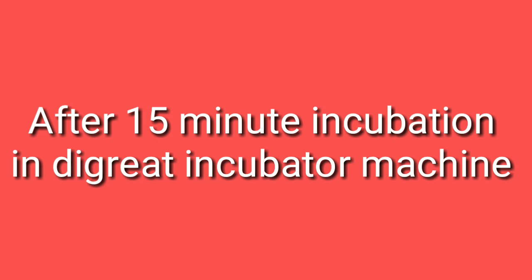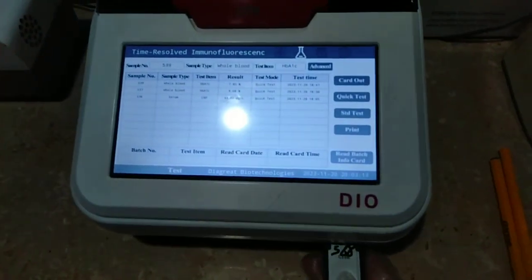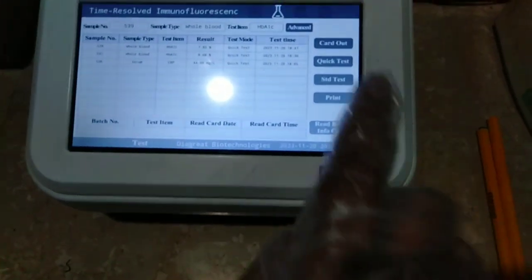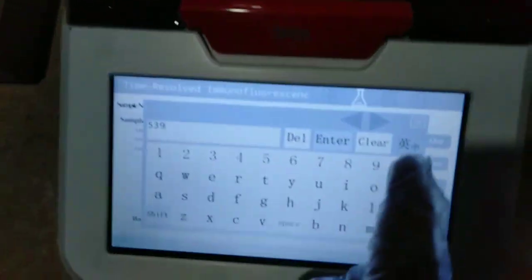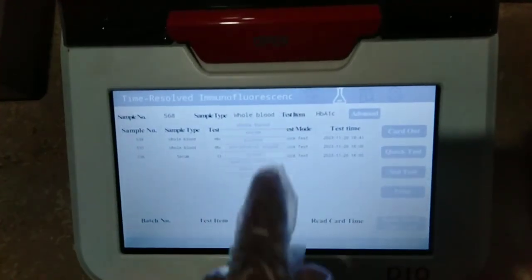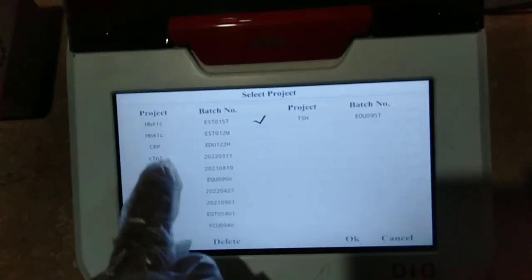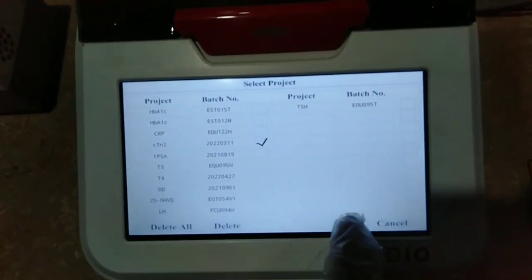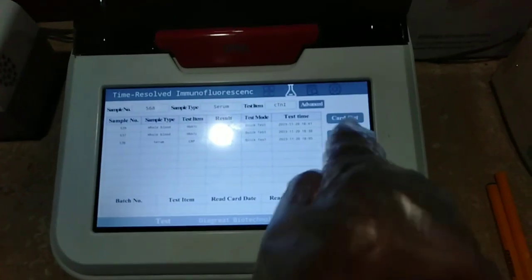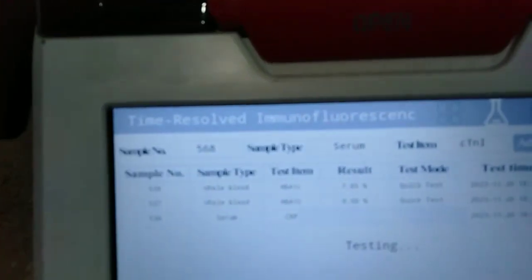After 15 minutes of incubation, we will take it out and then insert it into the Digrate machine — this is the Digrate machine. Then we will perform the test. First of all, we will enter the patient ID, then we will add serum because we perform this test with serum, and then we will enter the test name — Troponin Test — and then click on 'Click Test'.